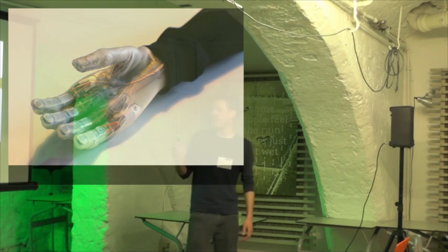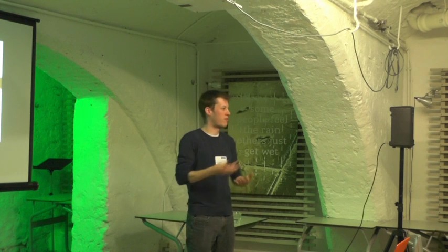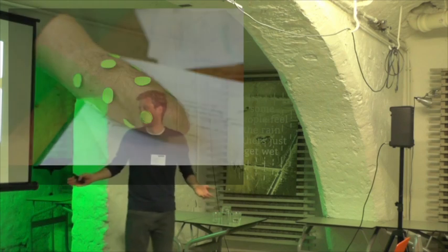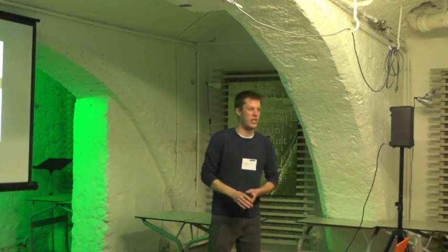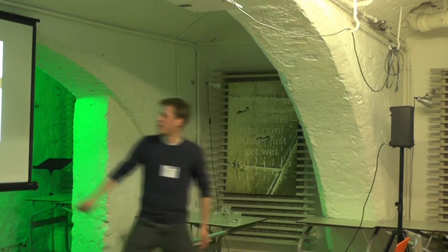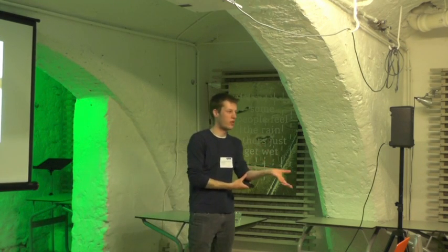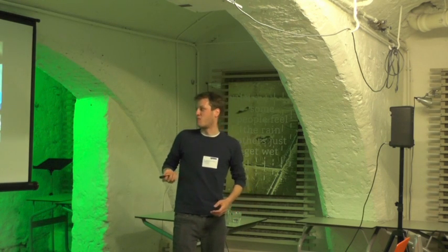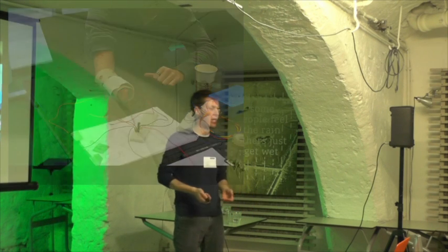Nicely integrated sensors in it. This is how we started with where the vibration motors could go, just to spread them around enough. For John, it was also the case that the front part of his arm just had less sensation in it, so we focused more on the lower side of his arm. You see a very tiny sticker there, that's where the sensors go to open and close the hand. We had to work around this. Some very simple testing, just to see if he could feel a vibration at all.